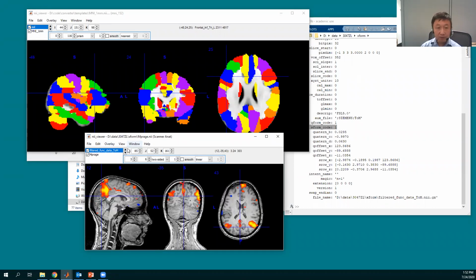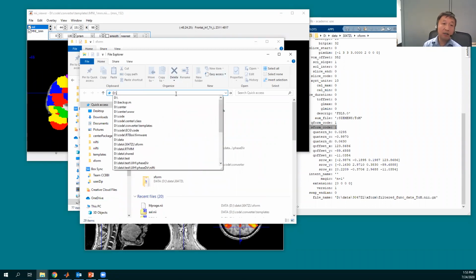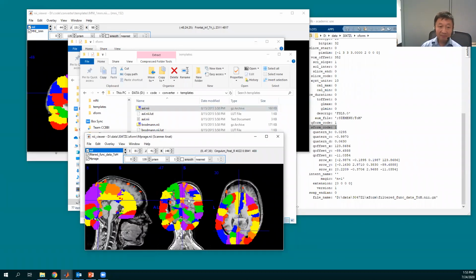If I overlay this one to the scanner and anatomy, you will see a warning saying the transformation is inconsistent. So probably the overlay is meaningless, but they still overlap a lot. That's because MNI uses ACPC as the origin coordinate. For the scanner space, we try our best to do that when we set the participant in the scanner, but each participant is different. It's not accurate. It's not completely off, but we can see it's off by something like 2 centimeters. There is plenty of overlap.